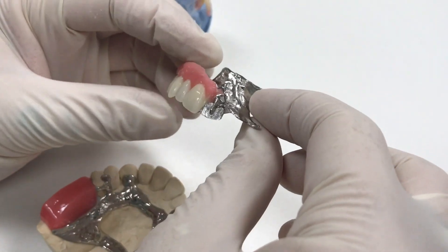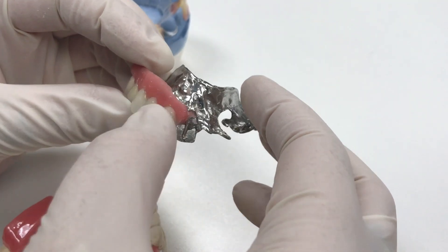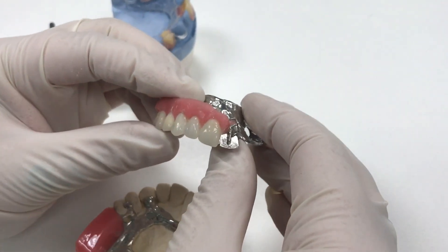We'll make the framework, set the teeth in wax, and send it out for a try-in where they'll double-check the size, shape, and color of the teeth. If everything's good, they'll send it back and we'll process for delivery.